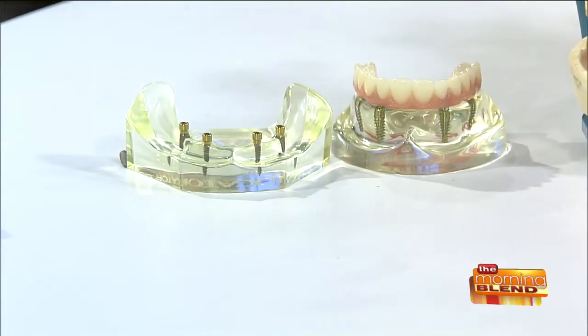So why would somebody need an implant? What are they getting them for? Is it because they had an abscess and they lost a tooth? Yeah, anybody who's lost a tooth can get a dental implant. Anybody who has lost multiple teeth, and in certain cases, they've lost all their teeth and they're walking around with dentures. Well, there are different types of implants that we could use, so they don't have to use the adhesive, like Polygrip and stuff like that, that a lot of people don't like. My mom hates it. I'll tell you right now. She uses it. She hates it.